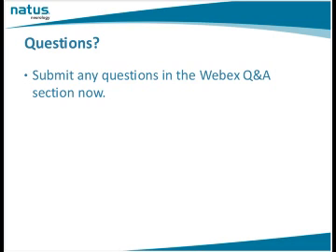Thanks, Katie. I do have one more. You mentioned tracing the MCA to distal depths. What is the significance when the MCA will not trace distally? The significance is that you are either on a branch of the middle cerebral artery or you're on the terminal ICA.